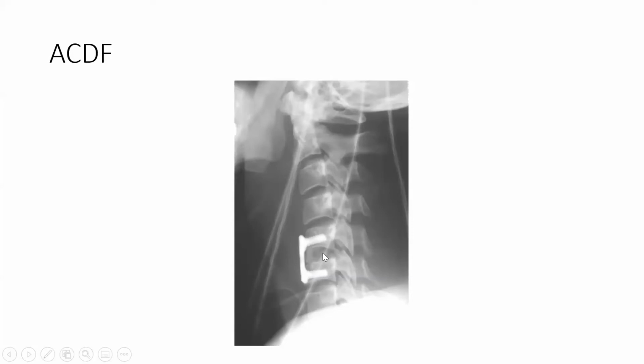If you harvest them with an oscillating saw, then you get thermal necrosis. With an osteotome, you get microfractures. So you often get subsidence and loss of height of your nice operation like this. Obviously, putting a plate on does prevent that. So I like a plate, it prevents collapse. But a plate also means more stripping and more likely to get adjacent degeneration and so on. So there are complications of plate.